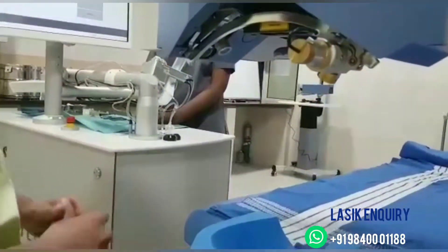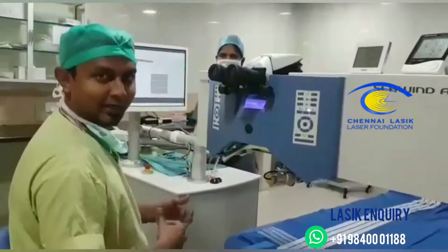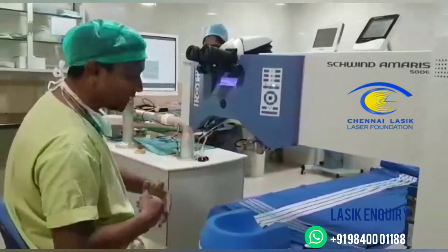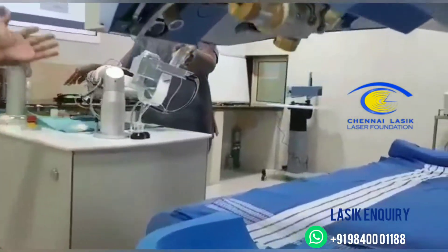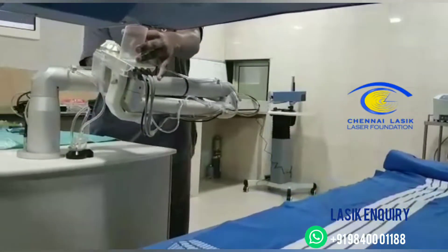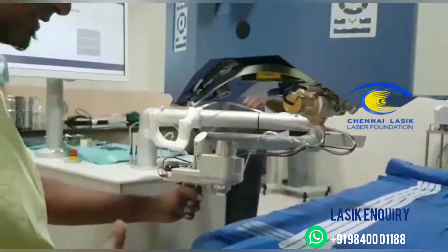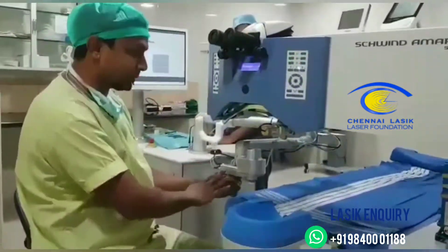This is a video to show how the Zymer Z4 machine arm works and how we are able to applanate the patient. Once all the system is ready, I ask the sister to give me the Femto machine. She moves the arm with a sterile hand, keeping her hand on the handle, which is then lifted and handed over to the surgeon. The best thing about this Femto is that I have the whole machine just in the palm of my hands.